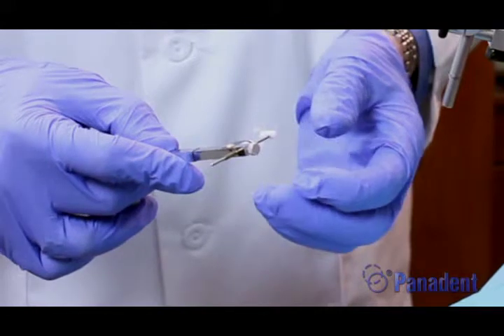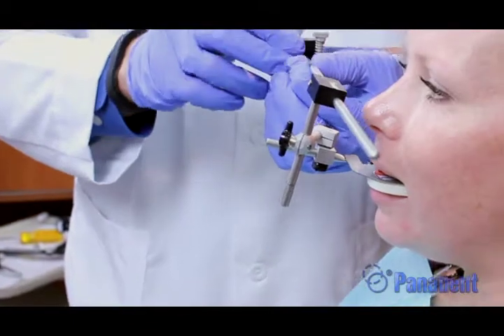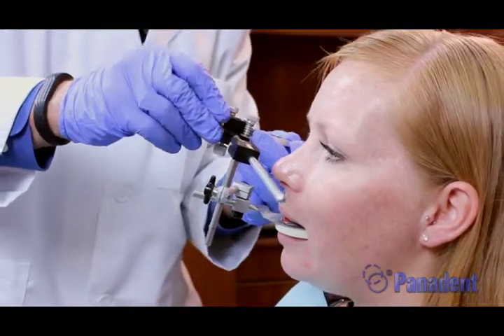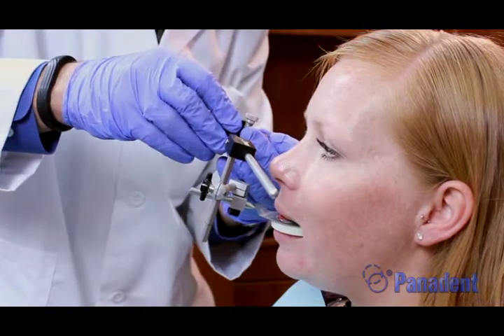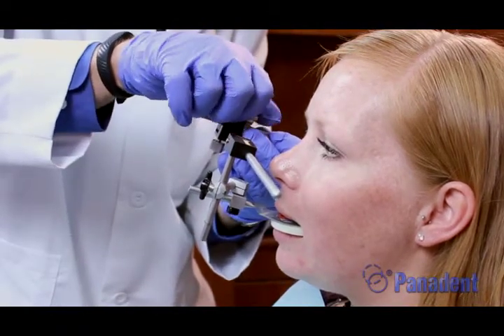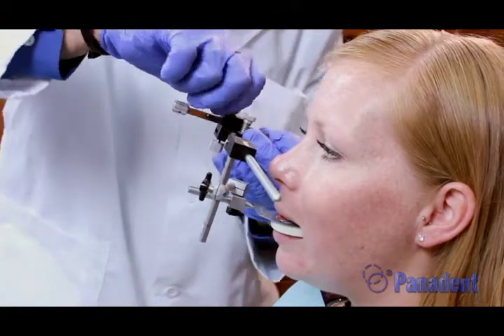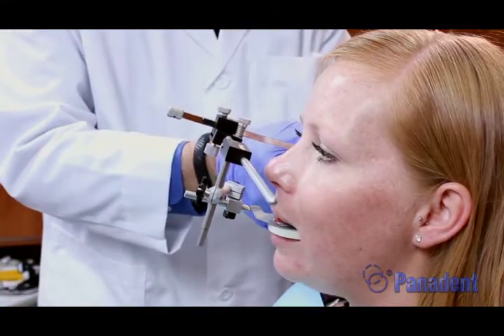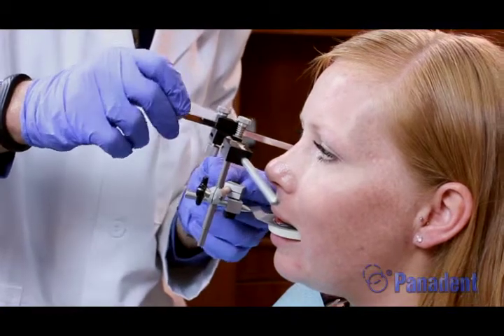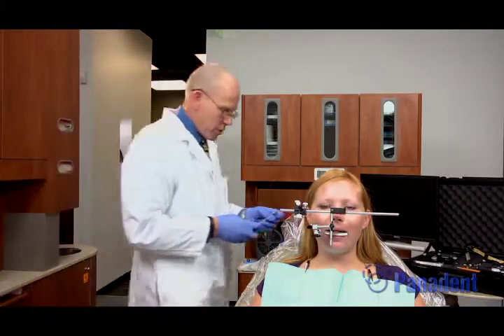The main thing is to have a Bennett ring there so when you loosen and pull it away during removal, you can re-index it back to the same spot. I'll put this back onto the crossbar and come back until I'm close to the hinge axis point. Then we tighten the large screw with the spring all the way down, and tighten the other small screw on top. I can use the micro adjustments to adjust up and down, forward and back to the hinge axis points marked on her skin. I've adjusted on this side — we'll go ahead and do it on the other side.